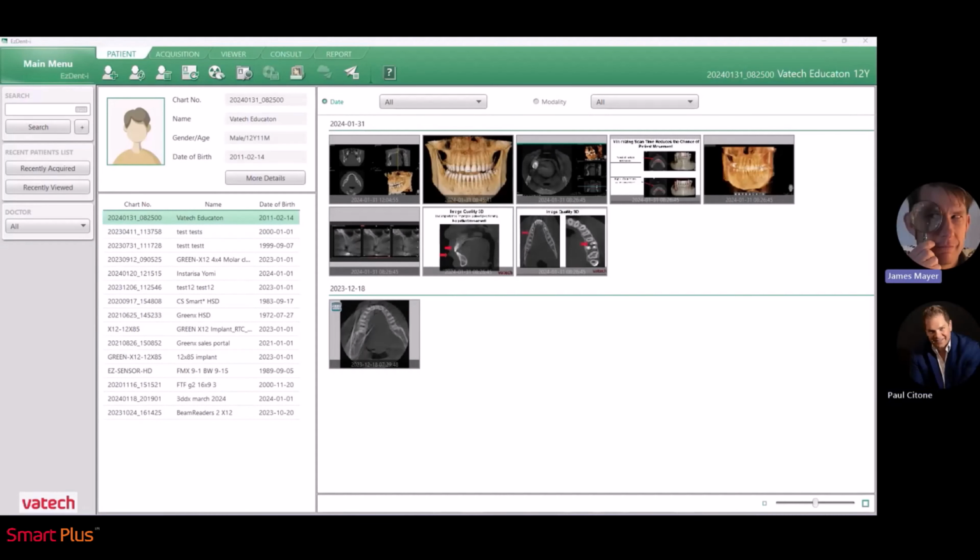So Paul, we just went through patient positioning on the cone beam here, and I think it's important to do a little bit of talking about CT image quality and evaluation. Would you agree? Yeah, absolutely. Taking a look at your images immediately after you take them is a great idea to verify you captured the proper anatomy and making sure everything looks the way it should. For sure, and I think that also does, when the patient's still there, then do I need to retake the image because I've just evaluated? So that's going to save a lot of headache for the office and the patient.